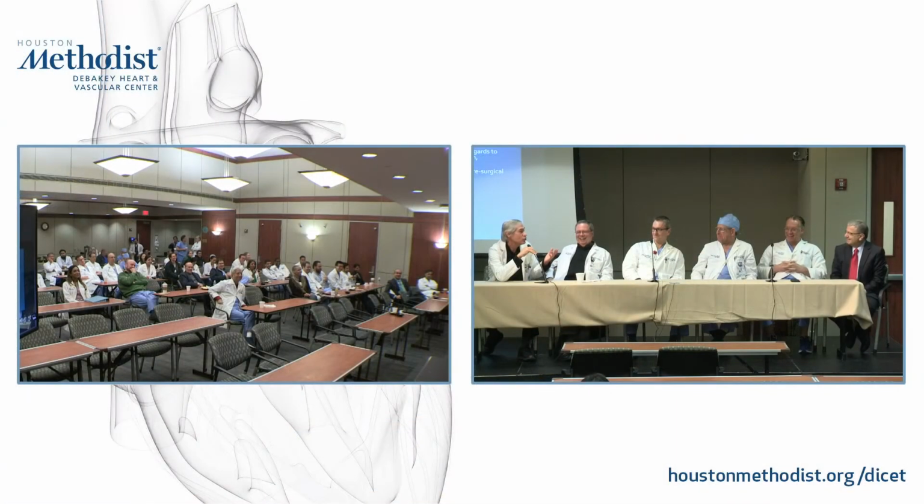And the other thing about CT, my voice is going up, is that it is three-dimensional. You get a complete three-dimensional view of the valve.